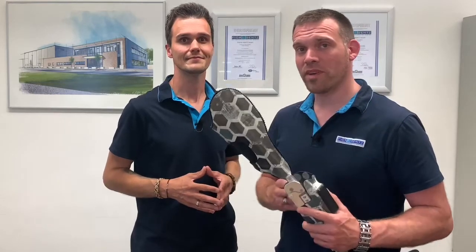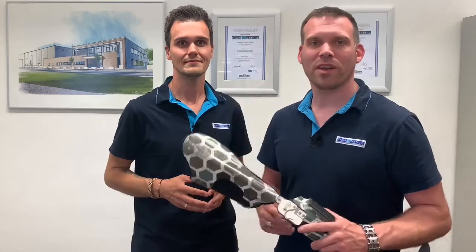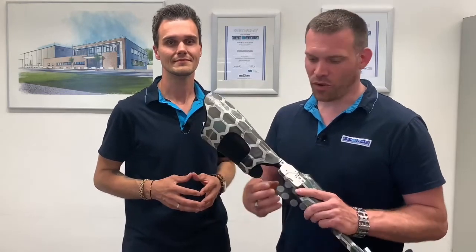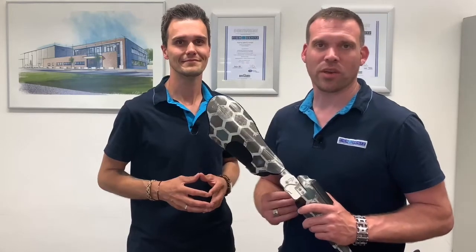You asked us if we could also show the assembly of the joint. Of course we can do that, and this is why we would like to go through the assembly of the joint, explaining how to do the maintenance of the neurotronic knee joint system. Have fun!